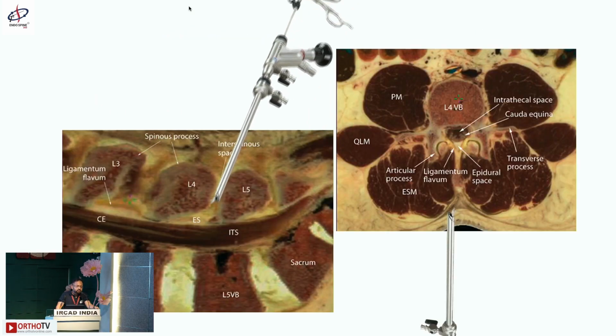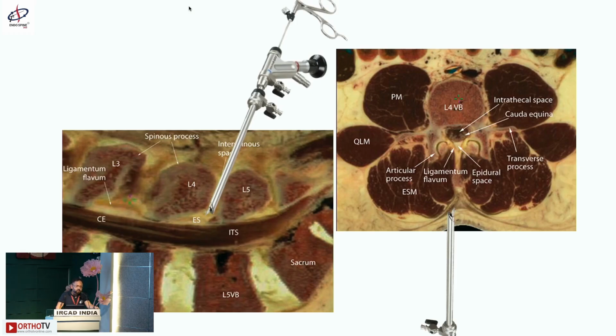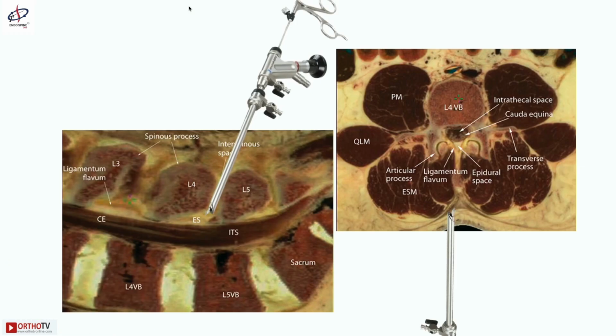Your target is like a sniper. You just put your gun in the window and start doing your work. In normal surgery, when you start seeing the lamina, you feel it is the end point of surgery and you are very happy. Here my starting point of endoscopic surgery is seeing the lamina. So we are avoiding muscle damage, and we are avoiding unnecessary waste of surgical time. Once you pick up the learning curve, endoscopic surgery is faster than open surgery.